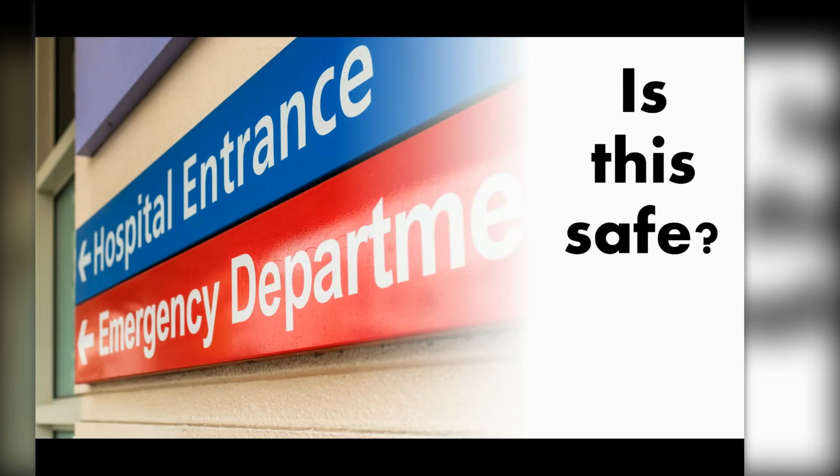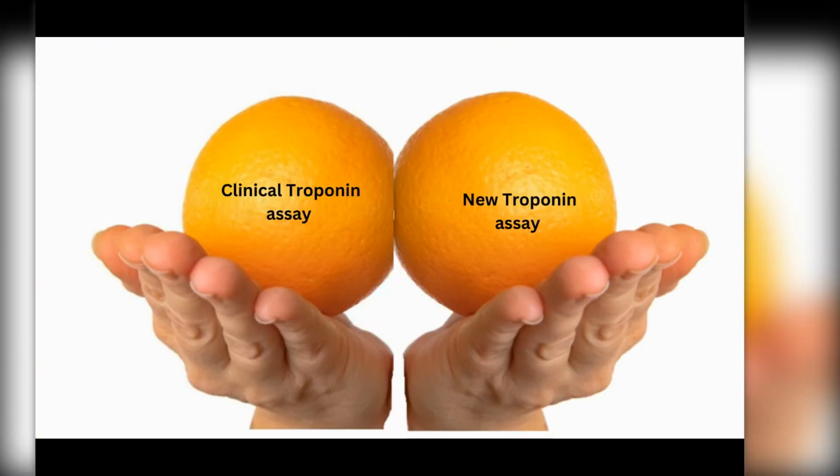So let's focus on the clinical question, which is this assay safe? And really what we're asking then is, can you provide us with diagnostic accuracy studies so that we know that this assay can safely identify patients with the clinical condition, and that is acute myocardial infarction accurately. Now, Fred has talked a little bit about this, so I'm just going to give you a different perspective. You'd think that this would be really easy. You know, we've just got 2 different assays, same condition, this should be great. But it's actually a little bit more complex than that.